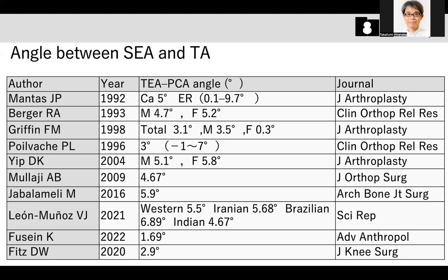In terms of the coronal plane, if the patient has 3 degrees of medial slope of the joint line, we always cut perpendicular to the mechanical axis. That makes a difference in the bone cut thickness. Then this imbalance of gap can be adjusted by soft tissue release.